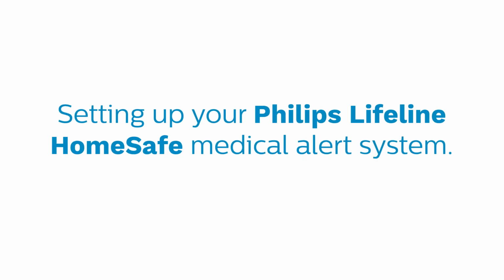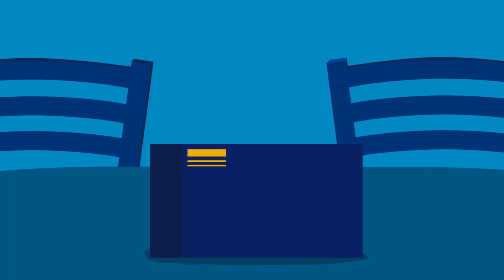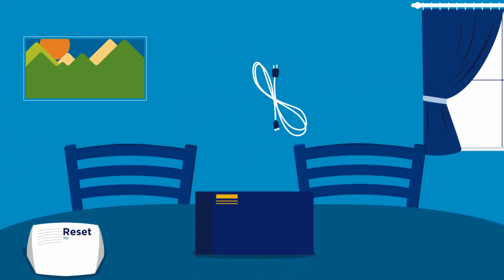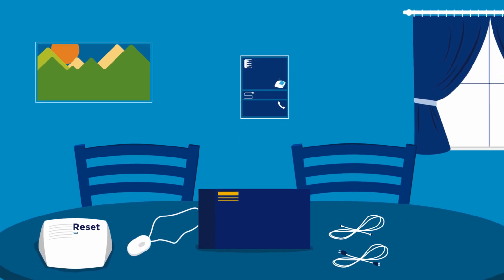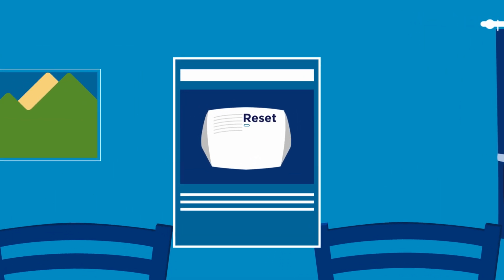Let's take a look at how to set up your HomeSafe medical alert system. When you unpack the box, you should have the home communicator, a power cord, a phone cable, a help button, a quick start guide, and a manual. Please take a few minutes to read through the manual.